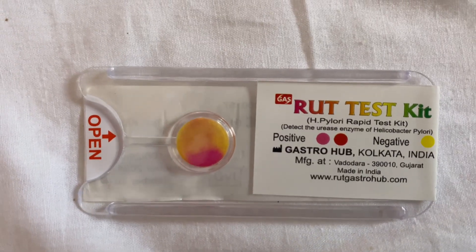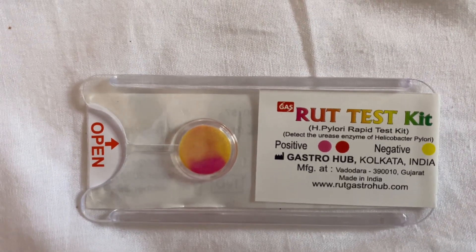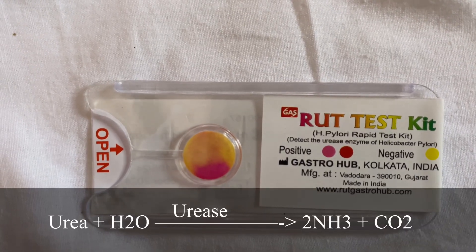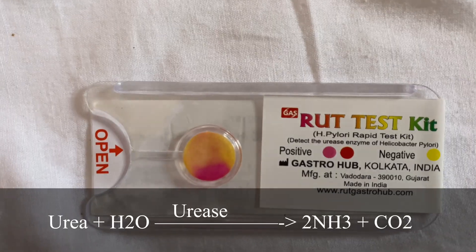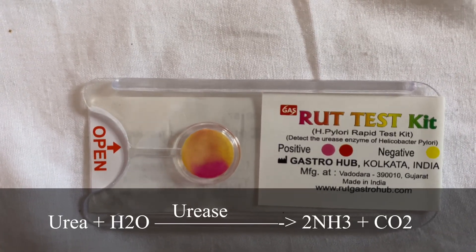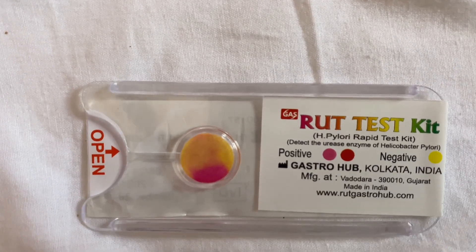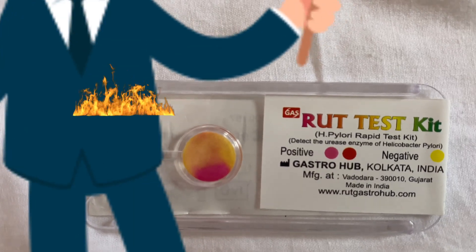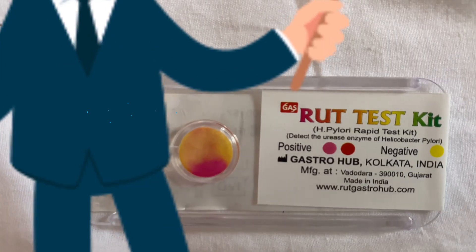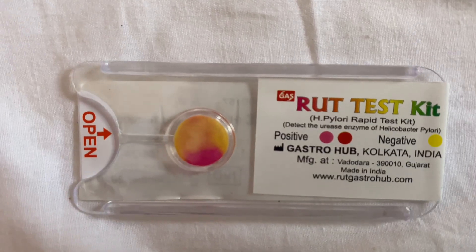Urease catalyzes the hydrolysis of urea into ammonia and carbon dioxide. Urea plus H₂O, in the presence of urease, gets converted into 2NH₃ (ammonia) and CO₂. Because of this reaction, the stomach's acidic media turns into alkaline media due to the ammonia, and hence helps in the survival of H. pylori even in the stomach.